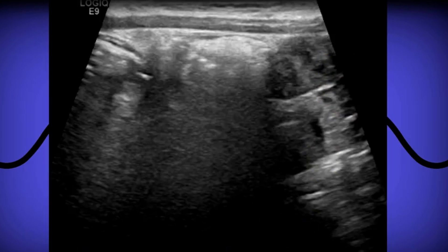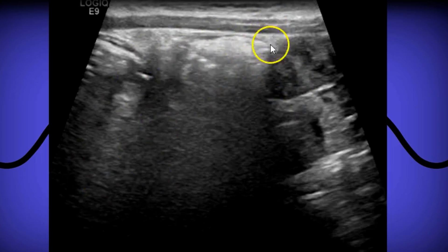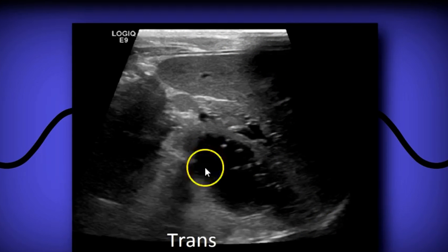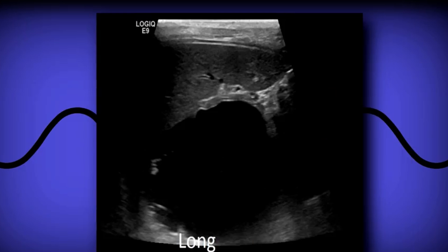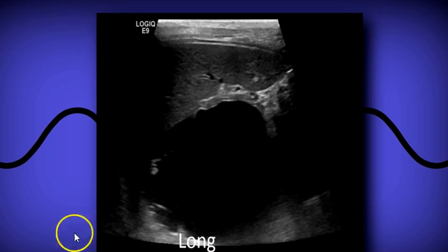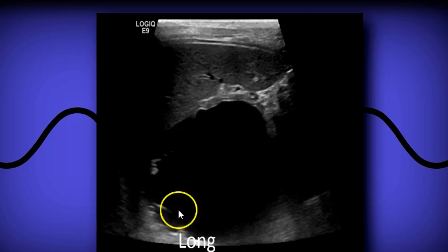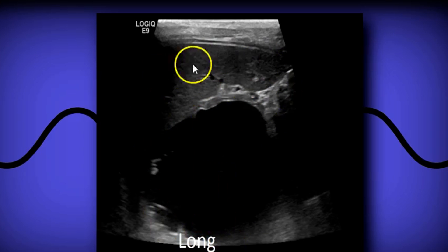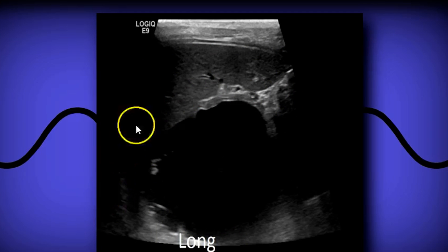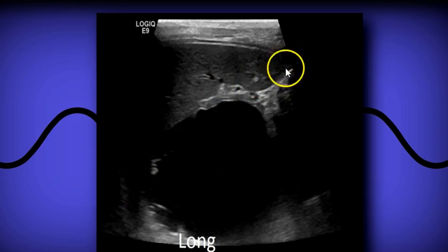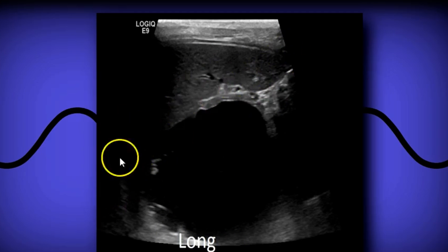Moving on to the left lumbar and left upper quadrant regions, you'll see a descending colon filled with air causing some shadowing. You're also going to see the spleen, stomach, and left kidney. In sagittal you'll see bowel, descending colon, and sometimes a fluid-filled stomach. You'll get the spleen and left kidney — that's a good place to check for free fluid at the tip of the spleen or in between the spleen and the left kidney.